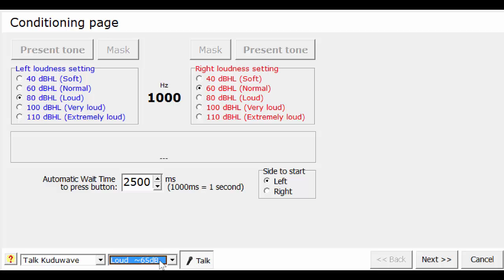It's maybe not a bad idea to actually take the history on the patient with hearing loss on this screen, because you actually create an artificial amplification hearing aid for the patient while you take the history. Then there's other options also.